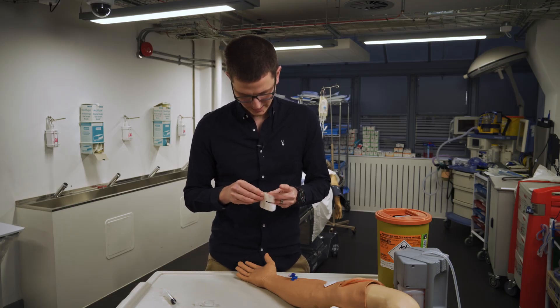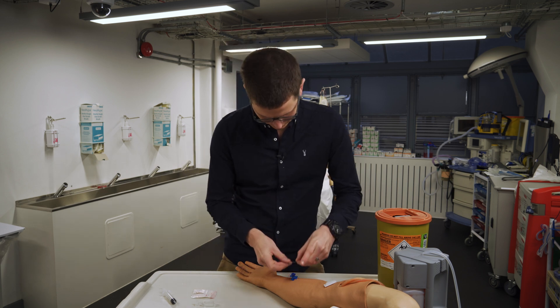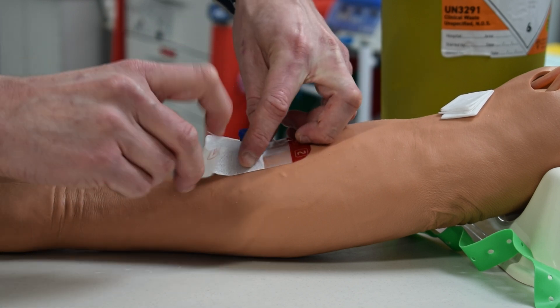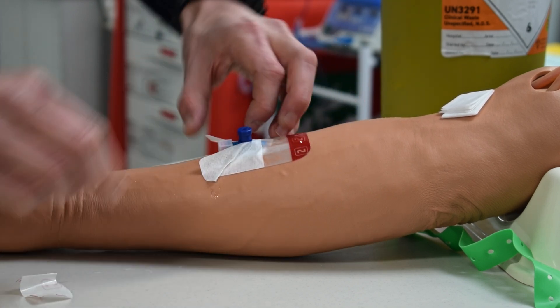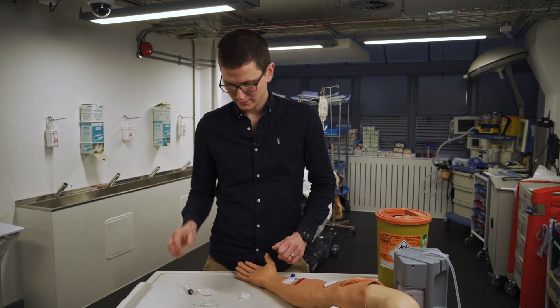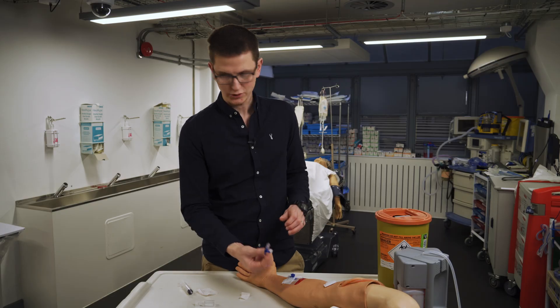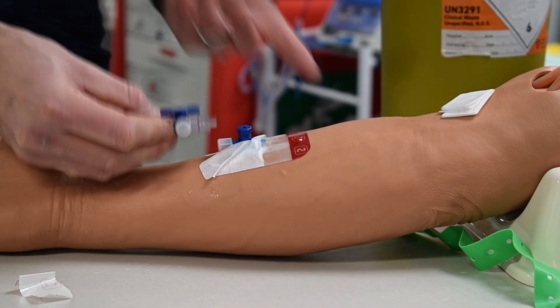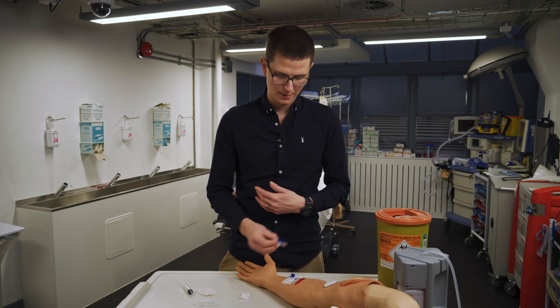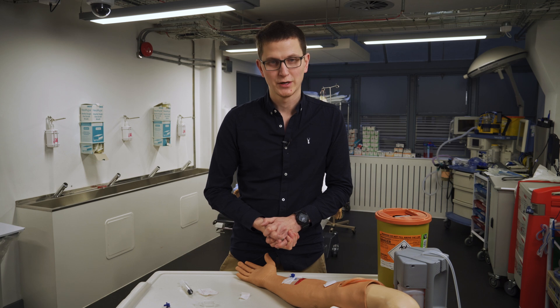When it comes to tying it down, there are many ways — some people use tape, whatever the case is. As long as the blue bit is taped down it's not going anywhere. If we need to give any fluids we push it through the top. If we want to attach anything else we can attach a three-way tap, which then allows us to give fluids and any infusions. That is how you put up an IV line.